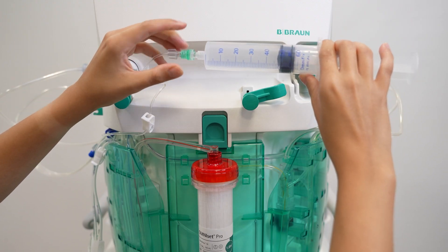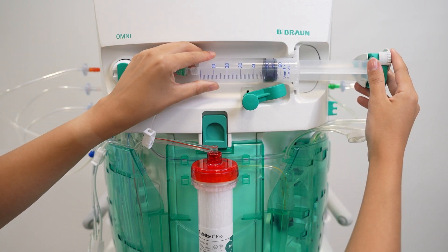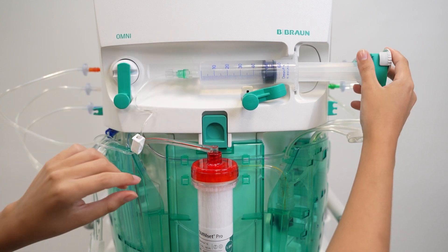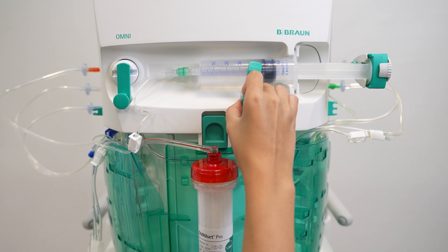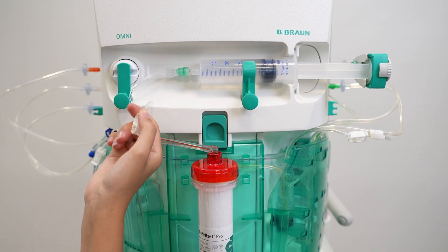Connect the heparin line to the heparin syringe. Insert the syringe piston plate in the clip and the gripping plate in the slot. Close the unlocking lever and the syringe holder. Make sure the clamp on the heparin line is open.